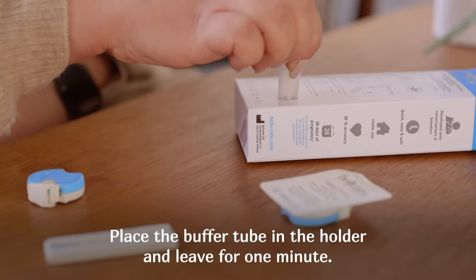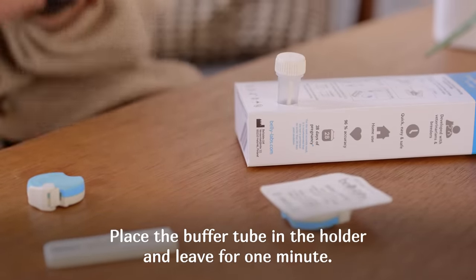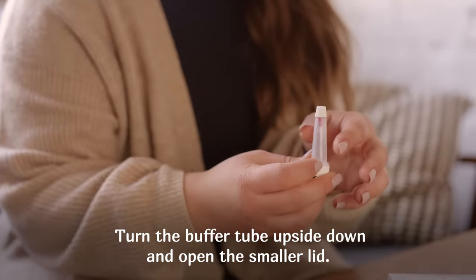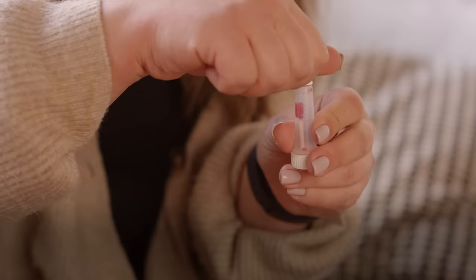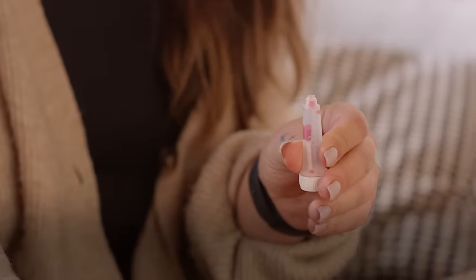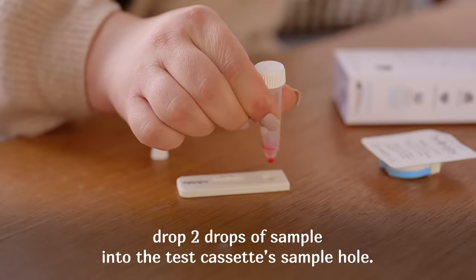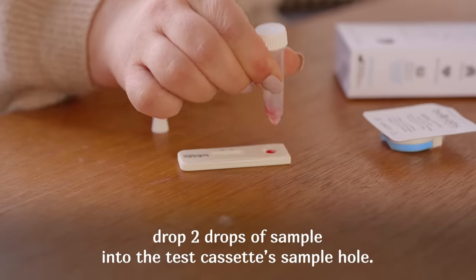Place the buffer tube in the holder and leave for one minute. Turn the buffer tube upside down and open the smaller lid, then turn the buffer tube upright again. Drop two drops of sample into the test cassette's sample hole.